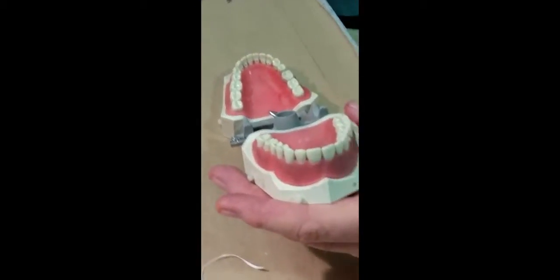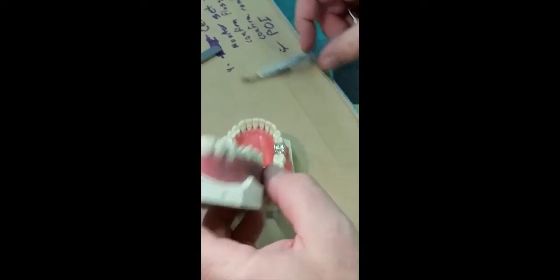The first step is to see where the contacts are before you put the crown in. Take the crown out, have the patient bite together. You can see there's good contact on tooth 31, but it seems open on 29. Ask the patient to bite firmly — it'll hold. When we put the crown in, we want to find the same pattern of occlusion, not shift it. That should have been adjusted on the models. Going in now, it's holding on 31.